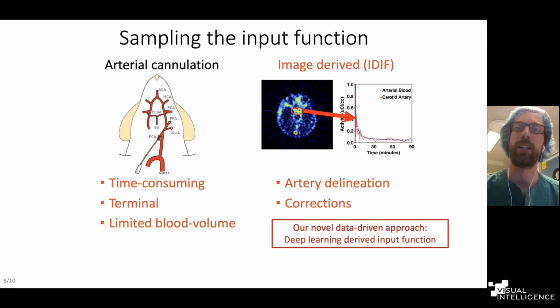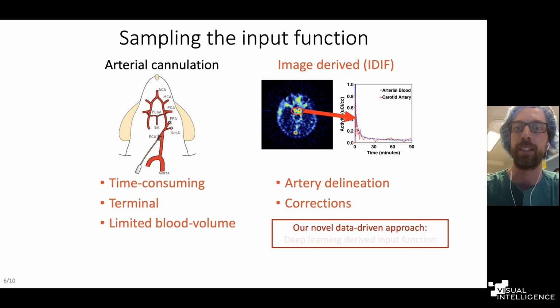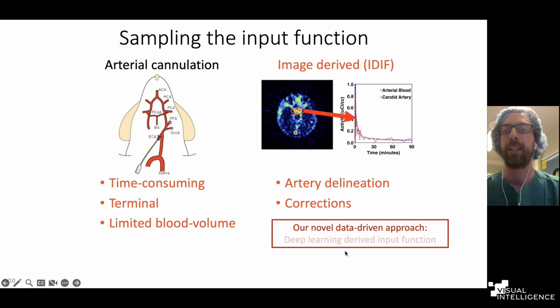So this is where our approach comes in. What we try to do is to predict this input function, this curve, from the images directly. So we call this deep learning derived input functions, or DLIF.